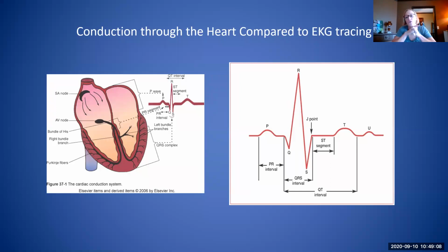Then you have a U wave there, which is usually benign. Some people just have them for no known reason, but it can signify hypokalemia potentially, or heart disease. But in a lot of people, it can just be benign.